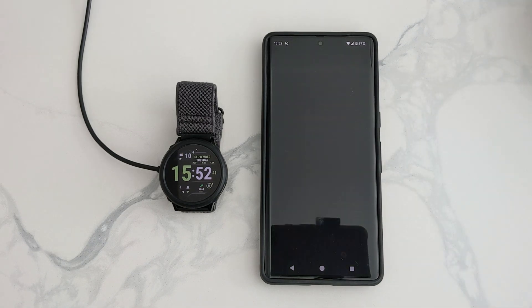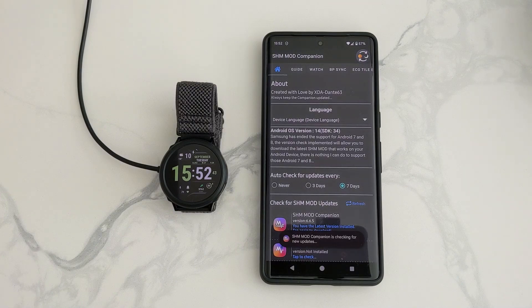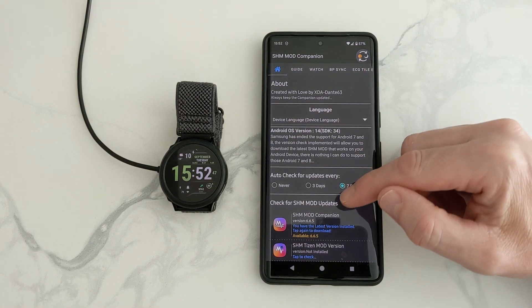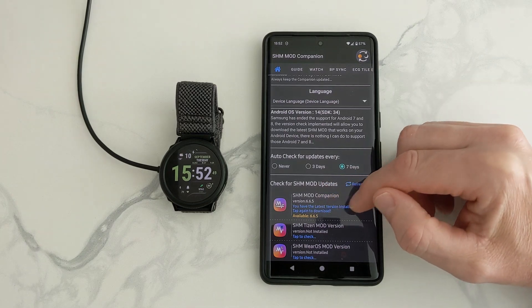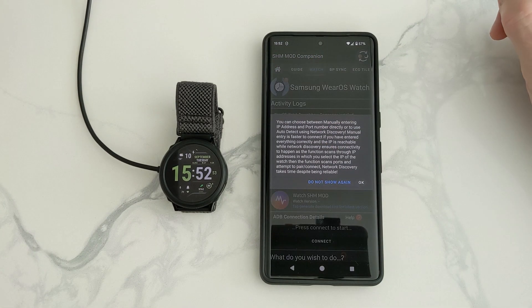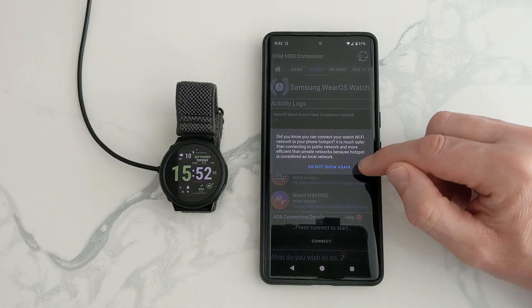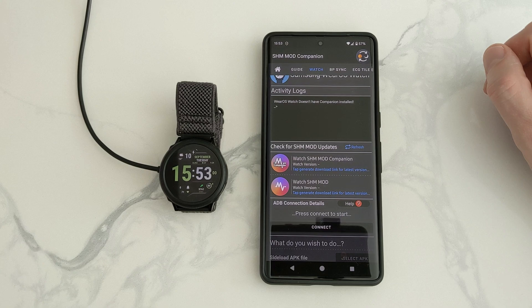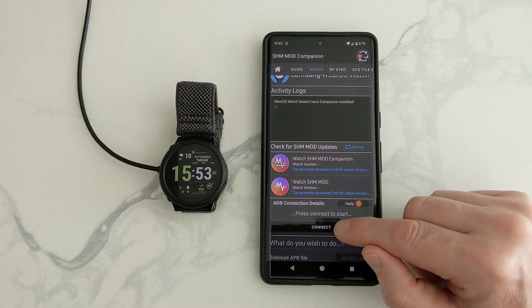Once installed, open it. Now it will tell you if you've got the newest app. You can also refresh it here if you want to make sure you've got the newest one. Then we go up to Watch, press OK, press OK. Now this is where we're going to connect the phone to the watch.